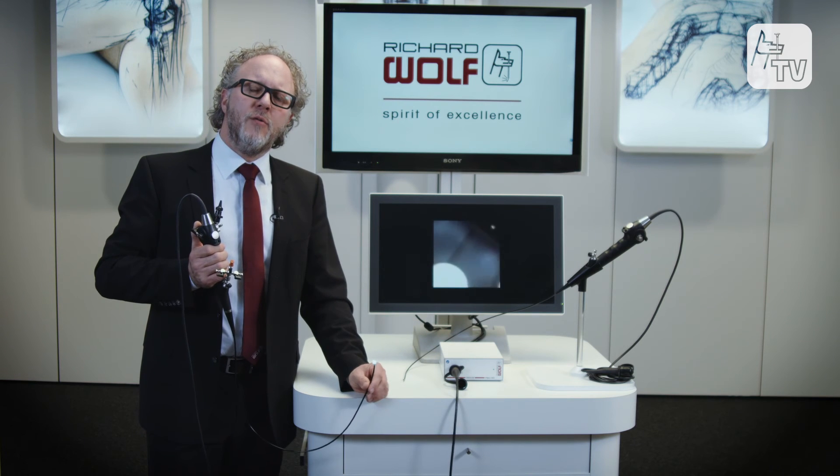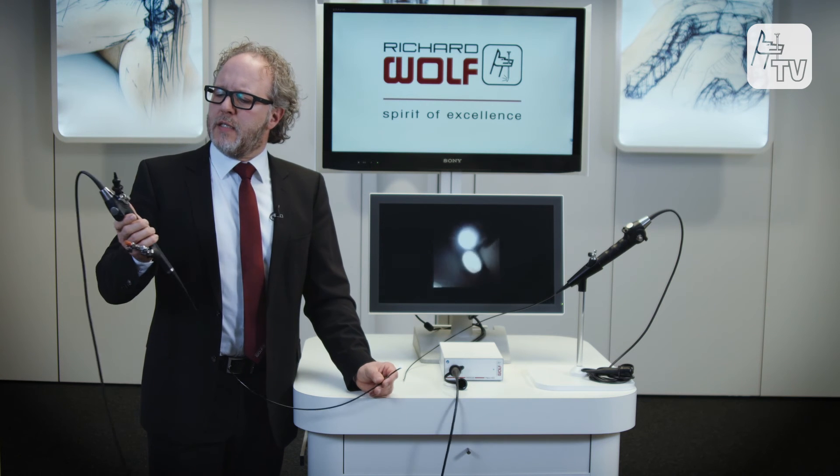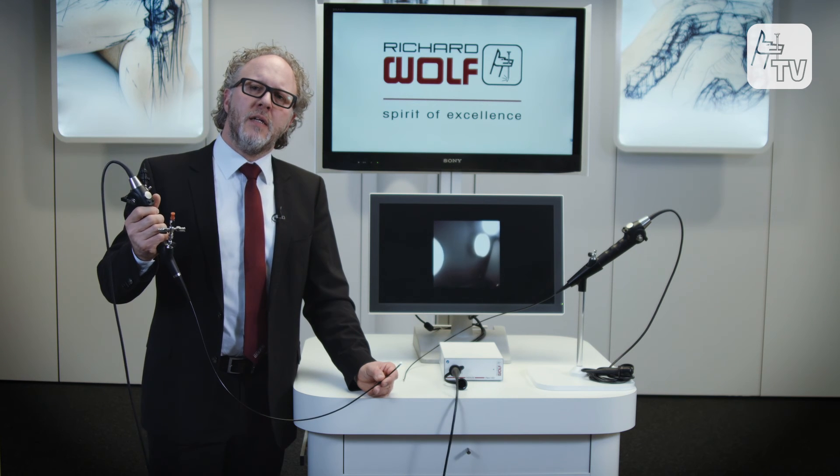These flexible instruments include the very thin single-channel BOA Vision ureteroscope and the unique Cobra Vision Continuous Irrigation ureteroscope, using plug-and-play with one chip camera head.